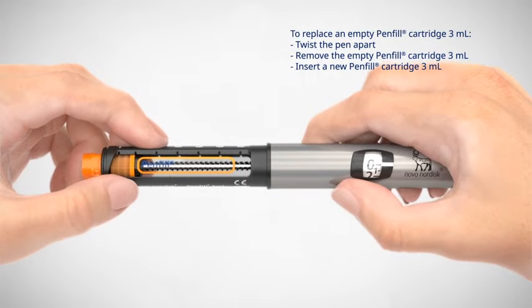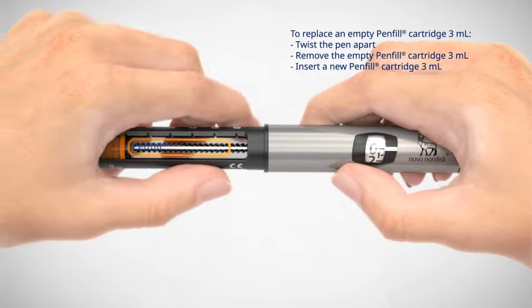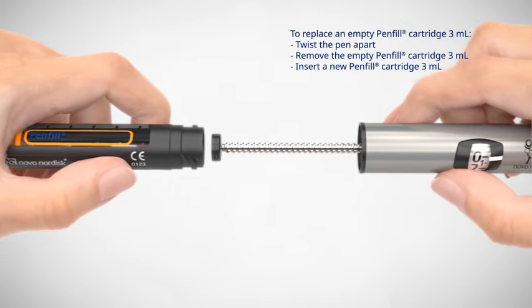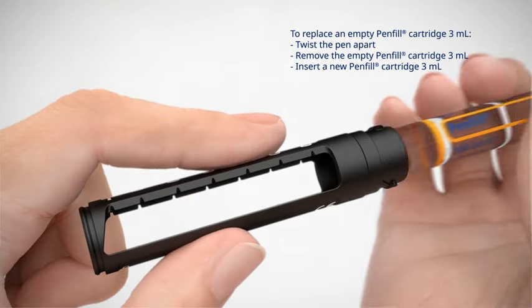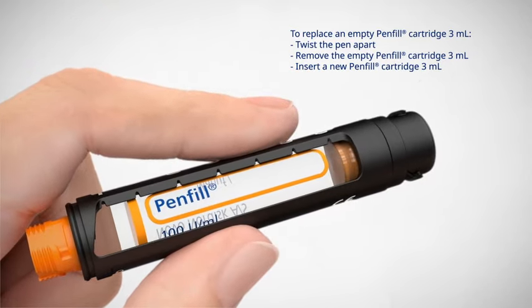When the pen fill cartridge 3 ml is empty, replace it by first twisting the pen apart. Then remove the pen fill cartridge 3 ml and insert a new one.